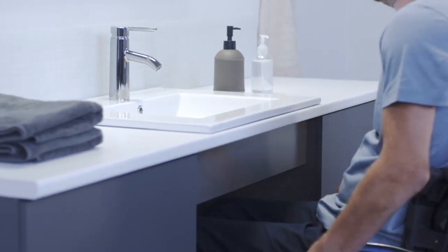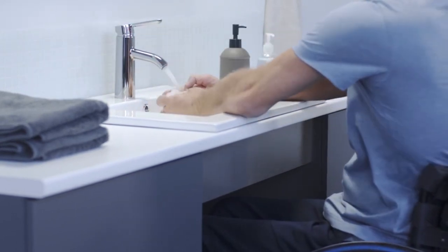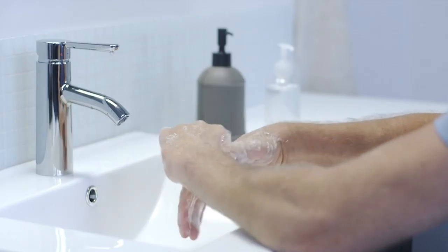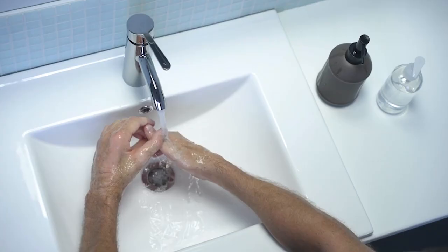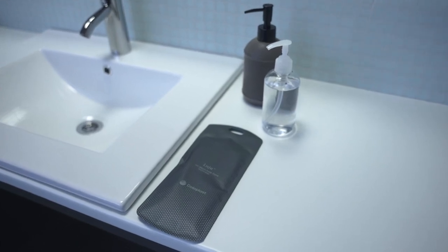It's important to avoid transferring bacteria from your hands to the catheter. Start by washing your hands thoroughly with water and soap, including your thumbs. You can use alcohol hand gel if you don't have access to washing facilities.